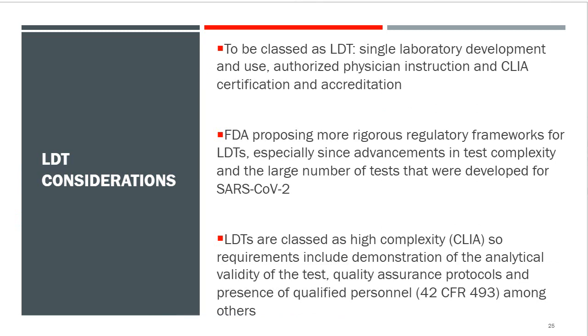A moment about some LDT considerations, lab-developed tests, and I don't want to spend a lot of time on LDTs, and we'll move on from here in just a moment. To be classified as an LDT, it's a single laboratory developed and used, authorized physician instruction, CLIA certification and accreditation, to be used only by that laboratory and will not be marketed outside of that laboratory or that facility that the laboratory is in.